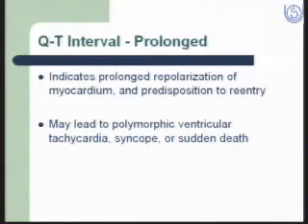Prolonged QT interval indicates prolonged repolarization of the myocardium and predisposes to reentrant arrhythmias and may lead to polymorphic ventricular tachycardia, syncope or sudden cardiac death. So the recognition of prolonged QT interval is very important.